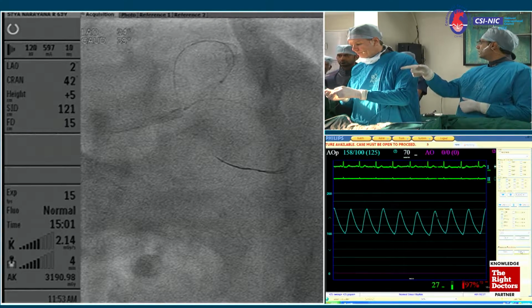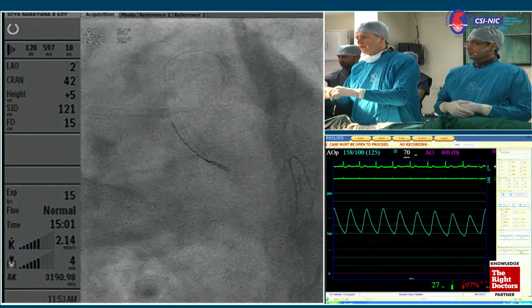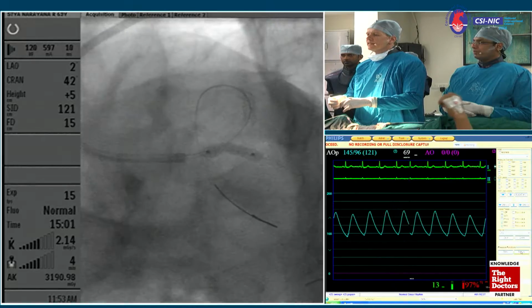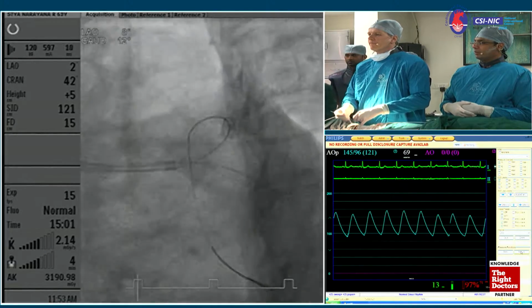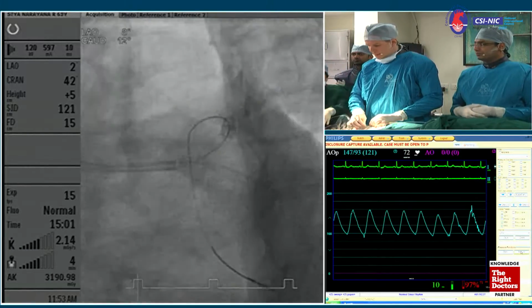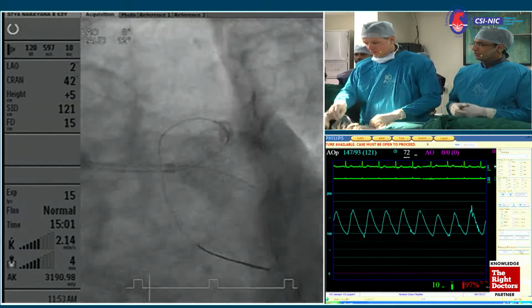Okay, will you show us please the result immediately after stenting. Show that. Go for EDS. Can we show it? Okay. Now please go to the result after stenting. After stenting. Yeah? Previous. Yeah. No, yeah. And from now there, next. You can start. Okay, from here we start. Just keep it there. We will do the rest now live.